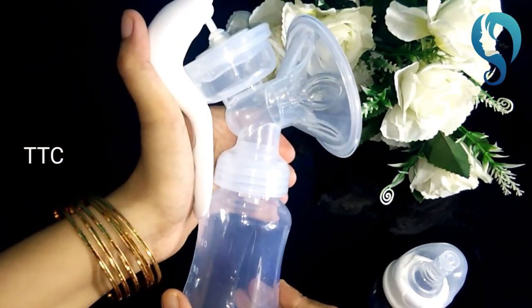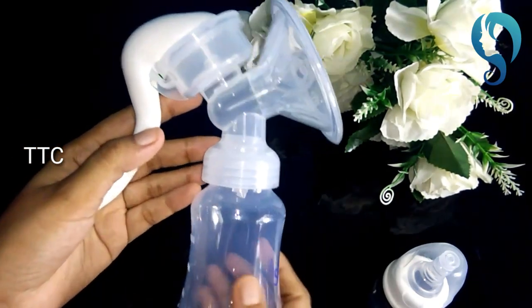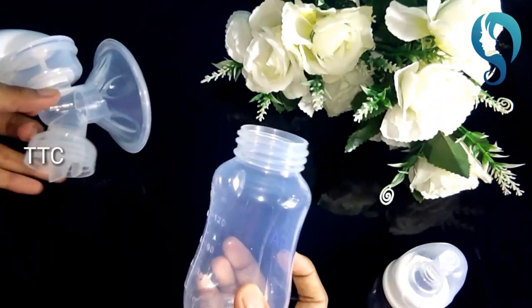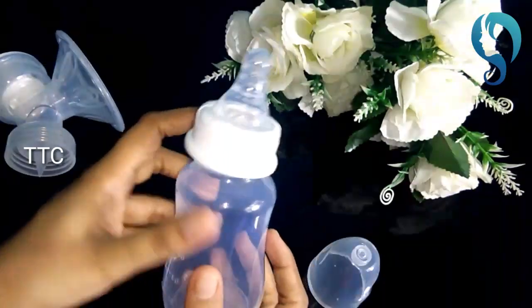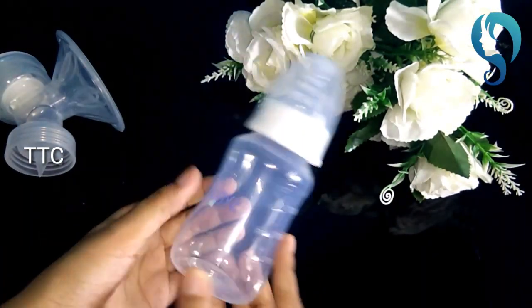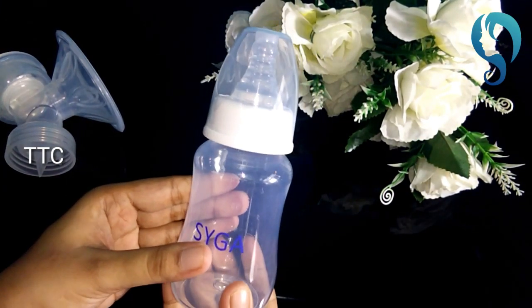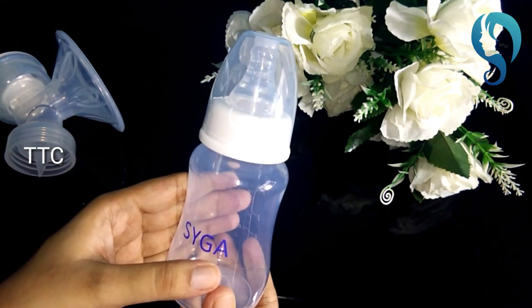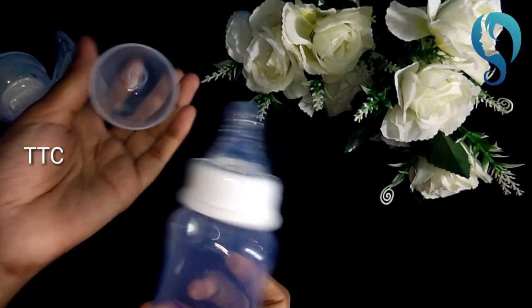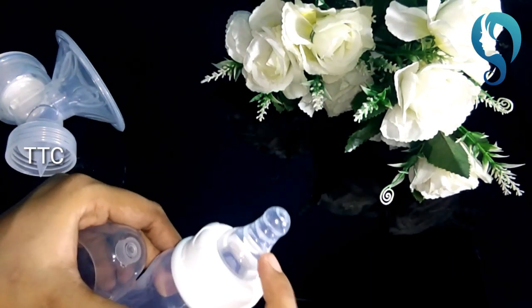When you press it, the milk will go into the bottle. The bottle would be very good — hold it steady. You can use a bag to carry it as well. It is very good for you, so make sure to keep your bag safe and carry it with you. You can use this as a palm-sized portable device — it is not bulky at all.